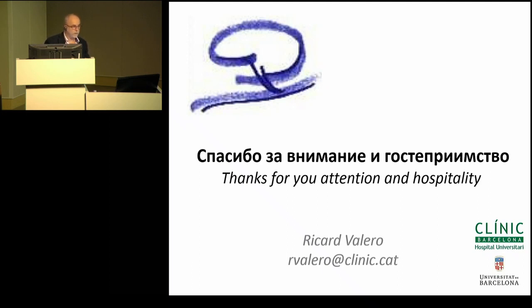We're doing it in our operating room. When the surgeon is going to do a temporary clipping, the neurophysiologist is controlling the EEG. It's a way to see if the temporary clippings have to be released because the patient is getting ischemic. So in fact, since we're using it, we stopped using the jugular bulb saturation to monitor this. The relationship between cerebral perfusion and EEG is immediate. Just after the clipping, if the clipping is not well done, EEG goes down. So the cerebral perfusion and the changes in the EEG are very connected.